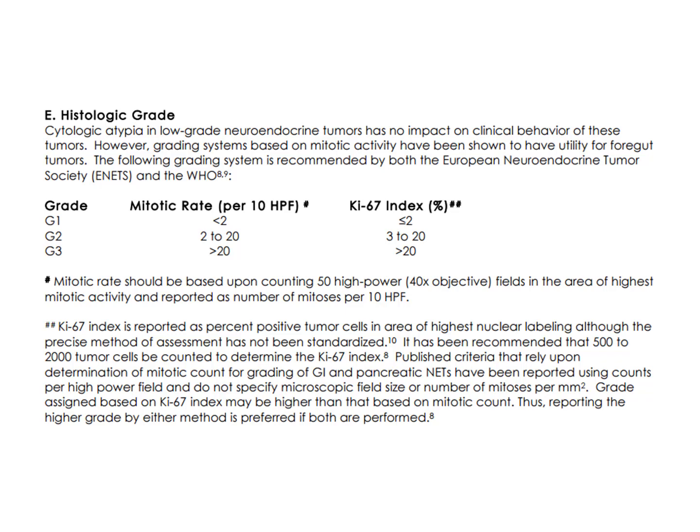The other change to the system is the introduction of a specific surface area for mitotic counts. In other words, you now need to determine the mitotic rate per 2 square millimeters. Importantly, this needs to be averaged over at least 10 square millimeters. You need to refer to the table in the CAP protocol. You also need to know the field diameter for your 40x objective.